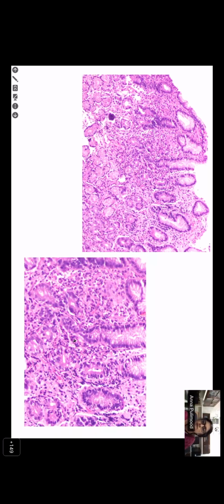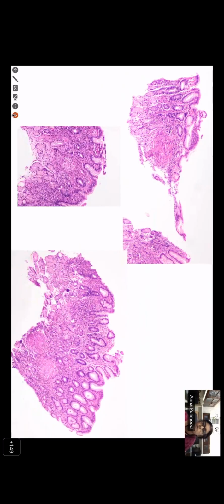What about these cells? Can you see something with smaller nuclei? Are there any neutrophils here? These actually are neutrophils. Maybe we'll see it at a higher magnification. Okay, we're not seeing that, but that was actually neutrophils. And now what you said.